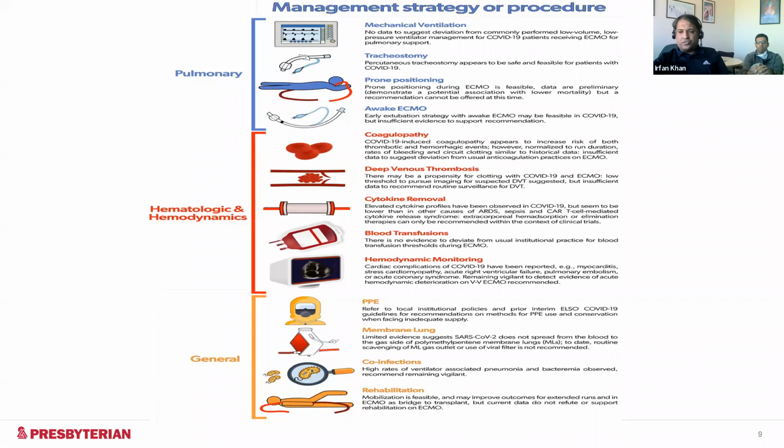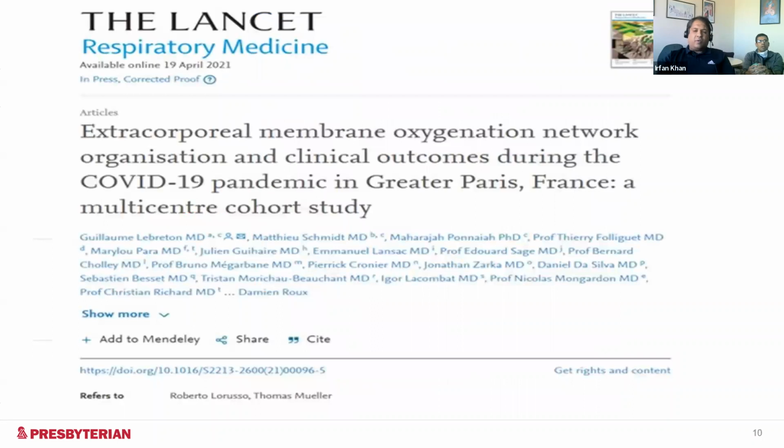Co-infections, again, are huge. So these can essentially increase the mortality. Rehab, so even if you've done everything, and if you haven't rehabbed the patient well, they're not candidates for lung transplant, or they just prolong hospitalization. So the question is, we are offering this therapy. Have there been studies lately that have supported the use of ECMO in this population? Does it even work? So based on that, this is a paper that came out in April of 2021.